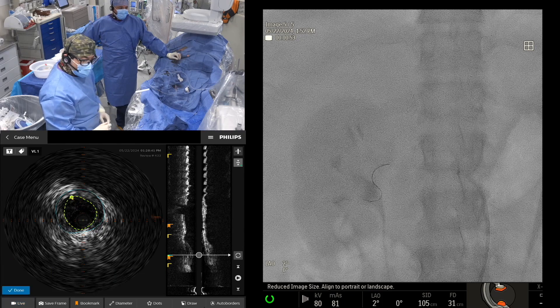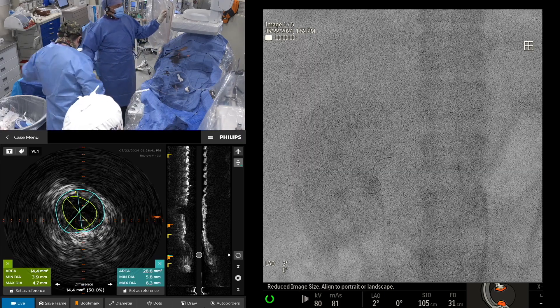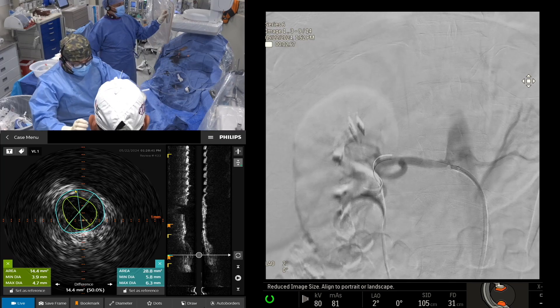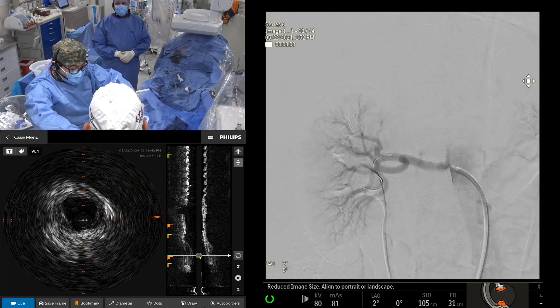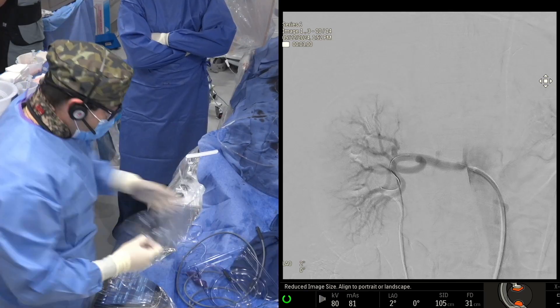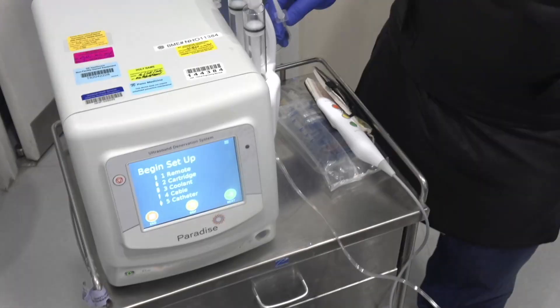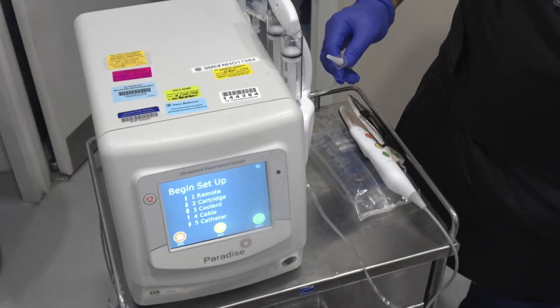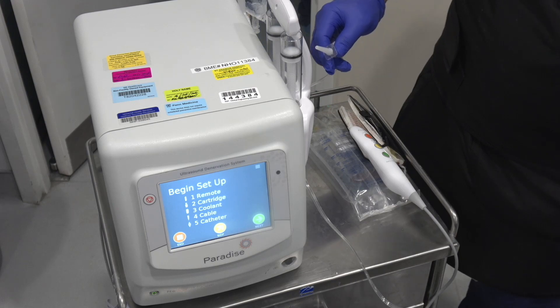The other thing to watch for is the branching. With the Paradise system, there is no reason to go to all different branches. You can see there's a large bifurcation, so we are going to stay proximal to the bifurcation. We've decided to go with a 6-millimeter catheter, which is being delivered to us. That's the delivery console — you can see the remote cartridge, coolant, cable, and catheter.